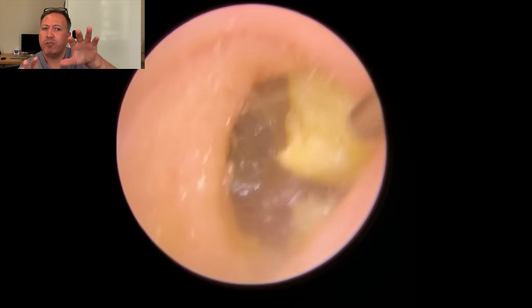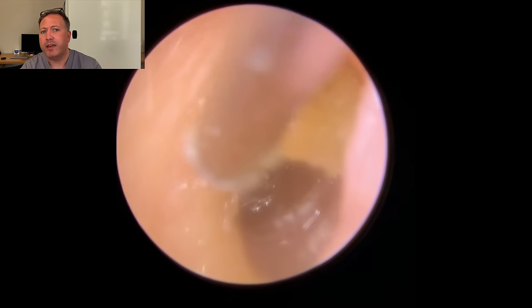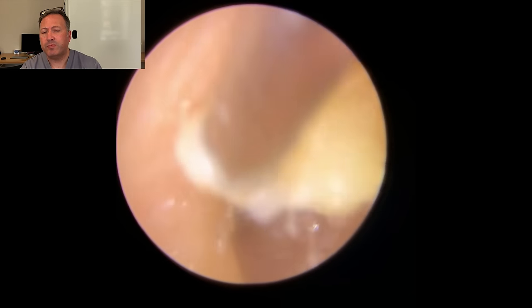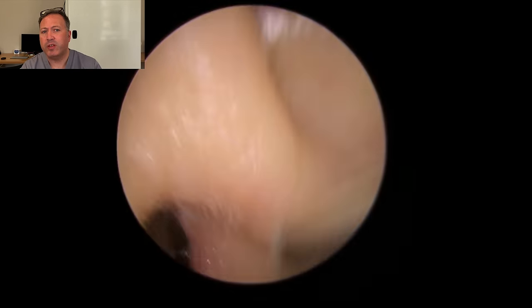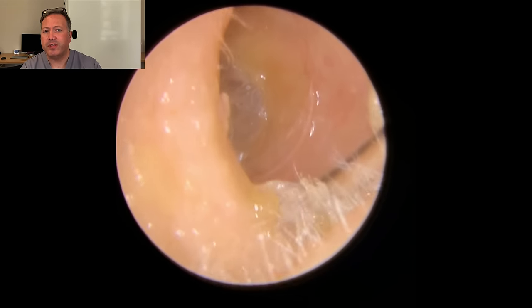So what we're doing first is clearing all this debris from the outer part of the ear canal here. Just pulling that down from the top right corner. There we go. And that means then we can get a much, much better view of this skin debris.